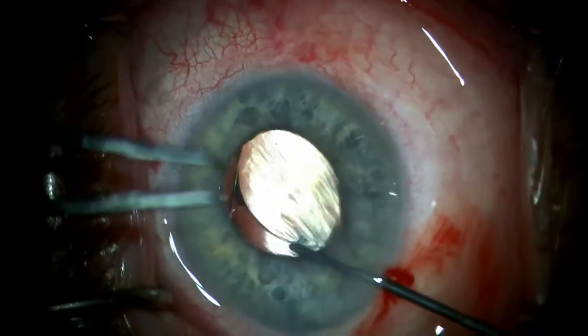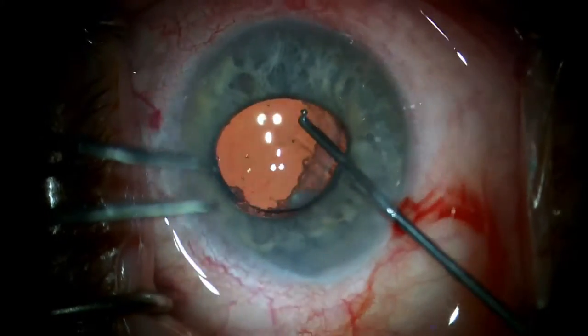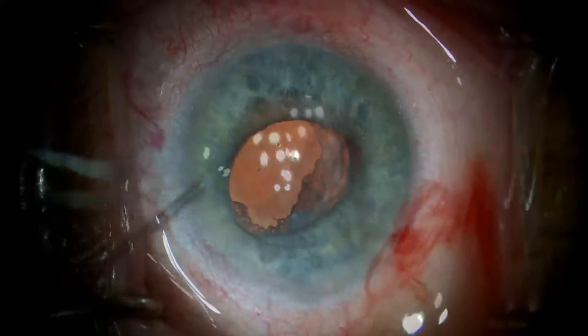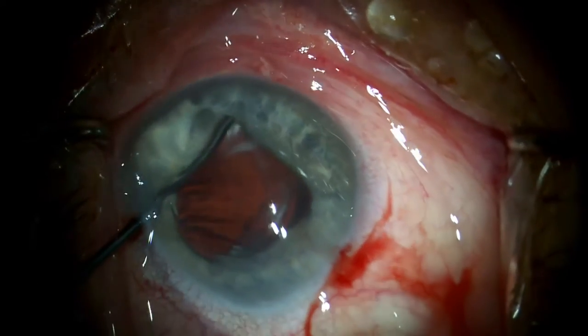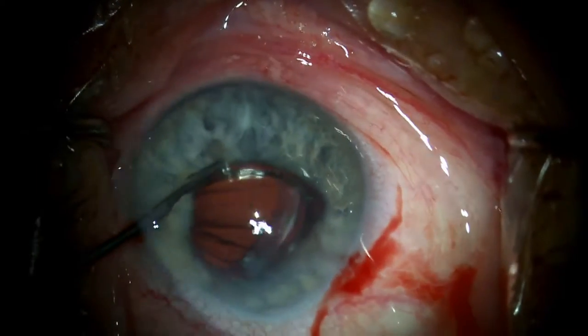In most instances, it is relatively easy to bring the optic anterior to the iris. Here we see the edge of the optic on the right moved in front of the iris. However, since this is a negative power, fairly rigid, one-piece PMMA IOL, it is not possible to get both sides of the optic positioned anteriorly.